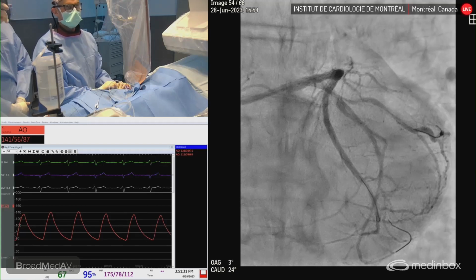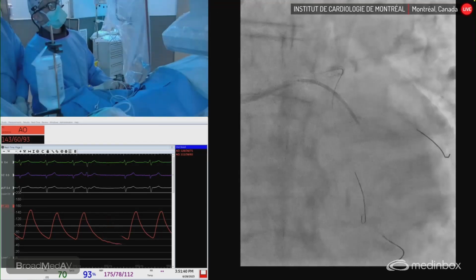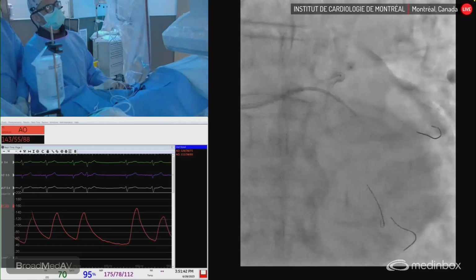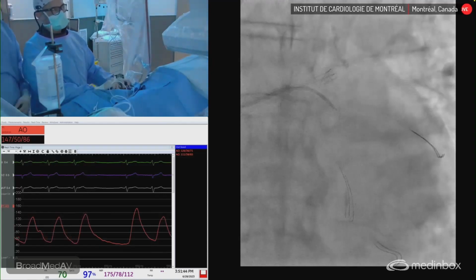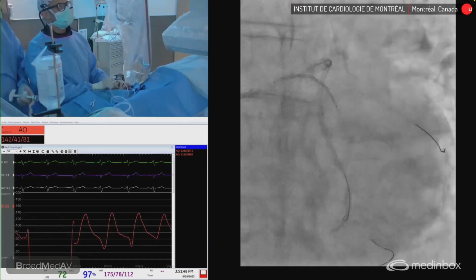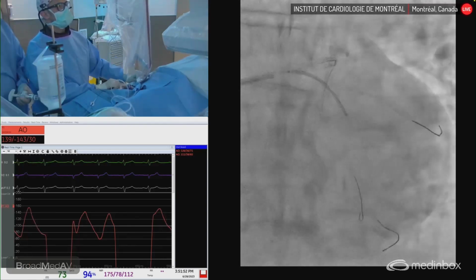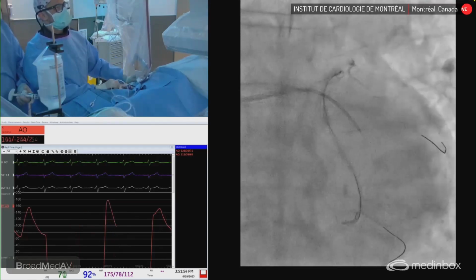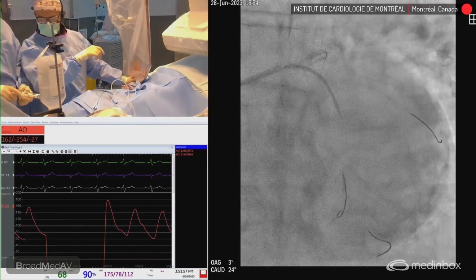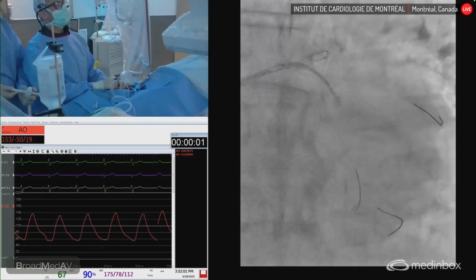The other option is to put that Megatron there, finalize, and go put another stent distal if you want. Okay, so you know what? I think I would stent like this and then maybe cover distally. Gaffe le guiding juste. Test. Just take a test. Yeah, okay. I would maybe stent like that. I think that's good. You will have enough space to do a pot at the end in the left main.